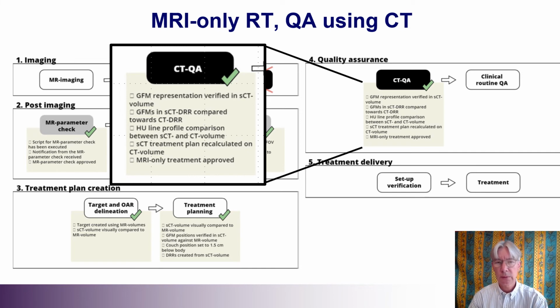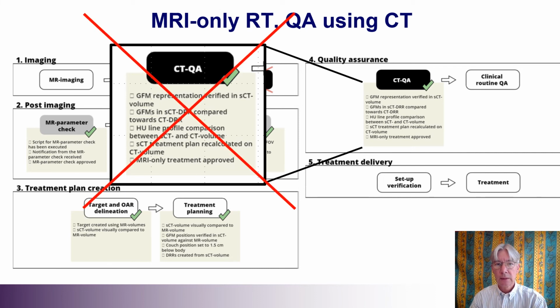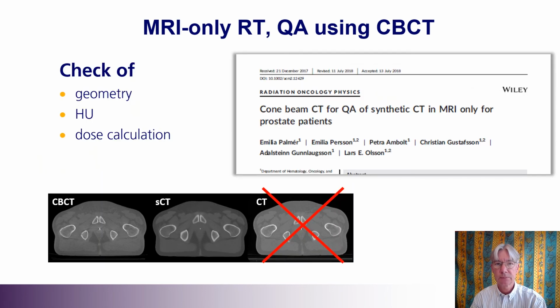So this is of course only in a study, or maybe if you are going just to implement an MR-only workflow in your own clinic, it's probably good advice that the first 10 patients have CT in the background, so you can check that all procedures are correct. Because once you go into clinical routine, there will be no CT data available, so it's better to check beforehand.